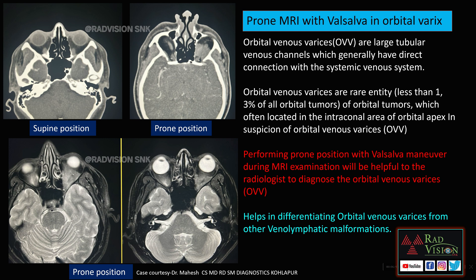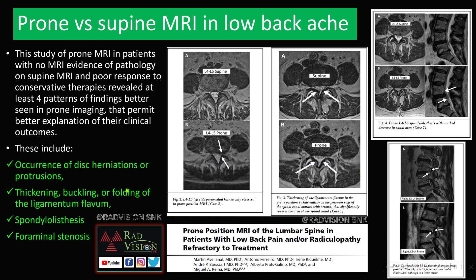Prone position is also useful in low back imaging. In supine patients, disc herniations, ligamentum flavum thickening, spondylolysis, or foraminal stenosis may not be clearly seen. Here you can see disc herniation is clearly depicted in prone, ligamentum flavum thickening is clearly depicted in prone, spondylolysis is better demarcated in prone, and foraminal stenosis is more clearly depicted in prone than in supine position.